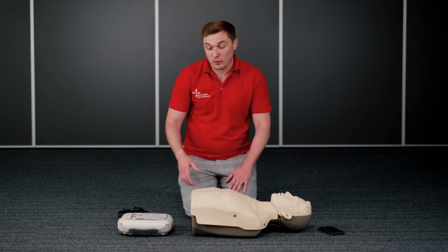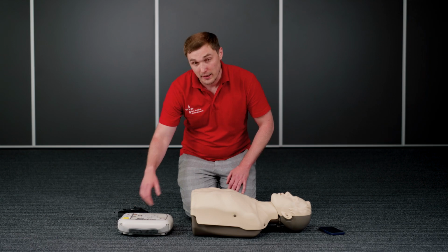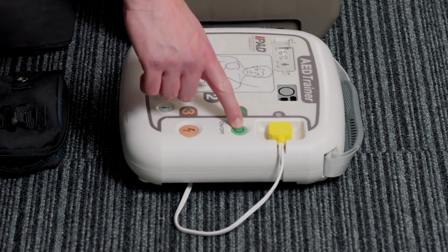So what we'll go through now is showing you the effective use of the AED just as I've described.